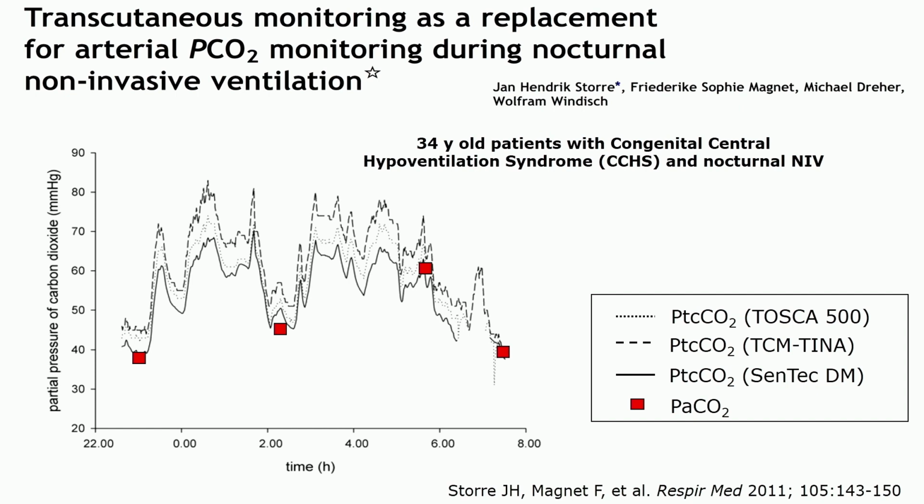In this scenario, you probably agree that we would definitely have missed detecting severe hypoventilation despite the application of non-invasive ventilation. You can see the CO2 values go up and down, probably depending on leakages, probably depending on sleep stages. And this is not visible and detectable if you don't go for continuous monitoring, whatever technique is being used.